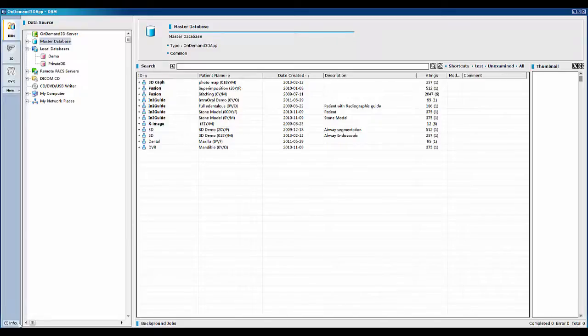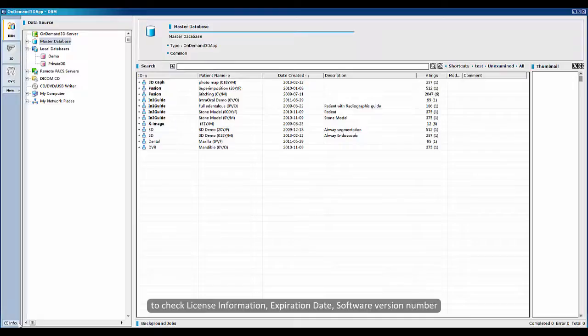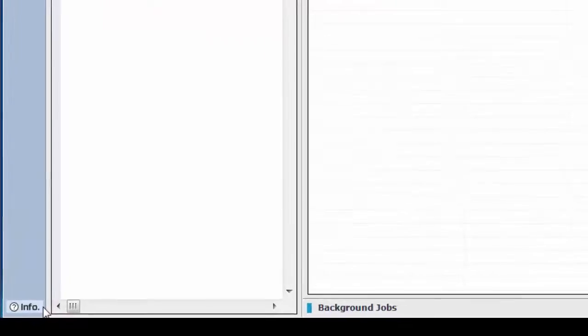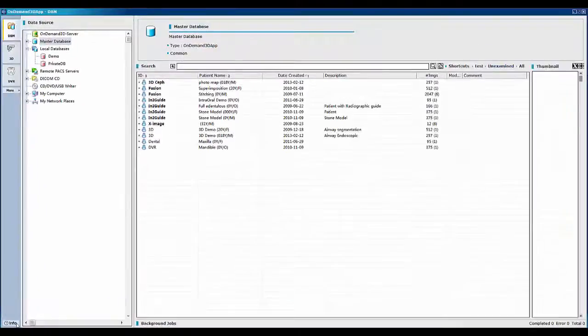First, we will show you how to track your software information. To track your license information, expiration date, software version number, and search, click on the info button found on the bottom left.